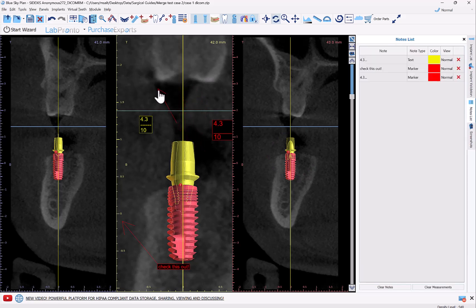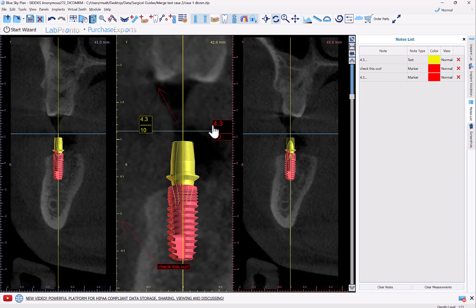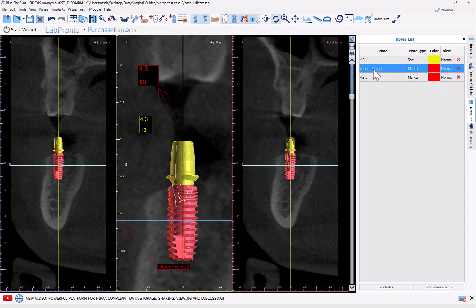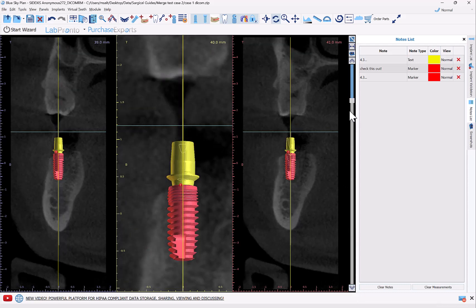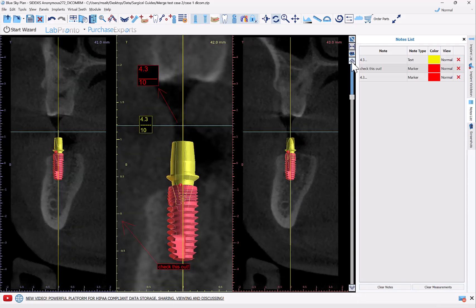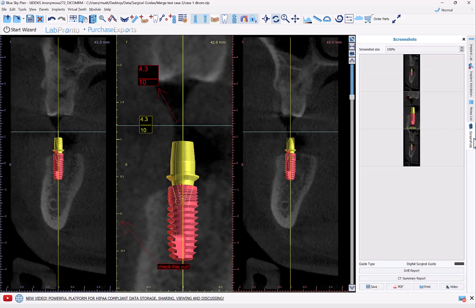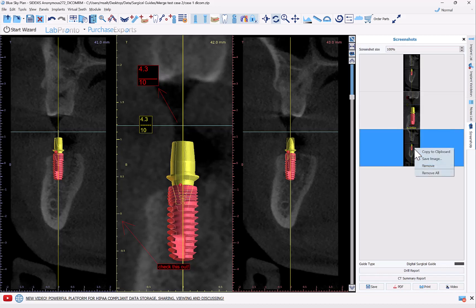You can grab the arrows and move them around. If you double-click, it opens up the different notes and annotations made on the screen, and you can modify, edit, or delete them. These notes are connected to the particular slice — if you move to a different slice the notes disappear, and if you go back they reappear again.